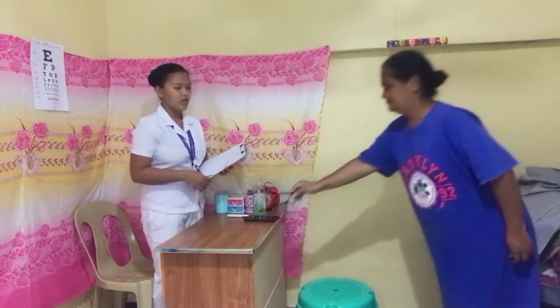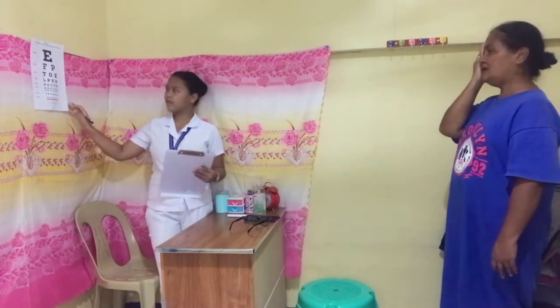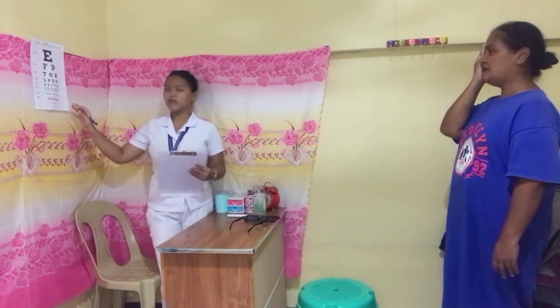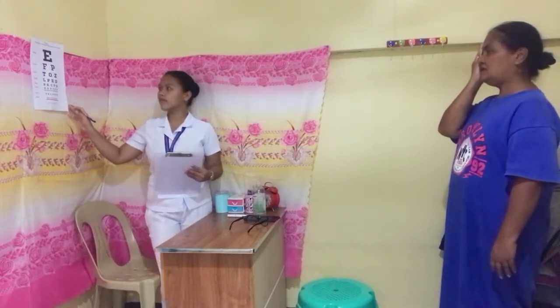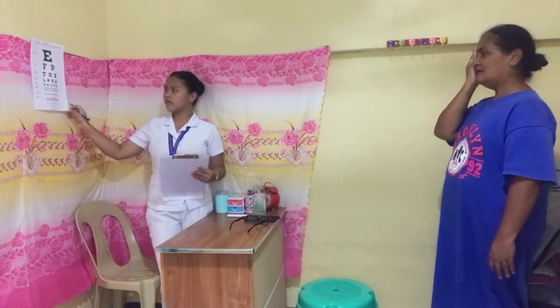Okay, thank you. Now, can you cover your right eye and read each line? E F P T O Z L P E D P E C F D E D C O Z I C Z P F C L O P C D. Okay. Cannot read it anymore.